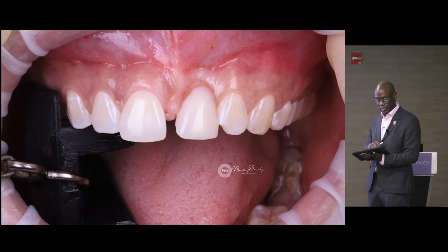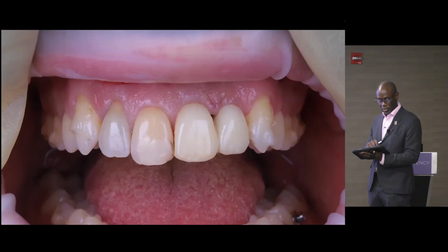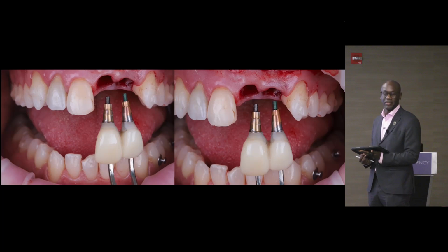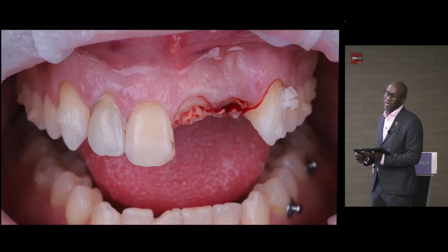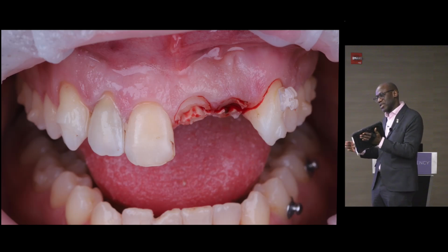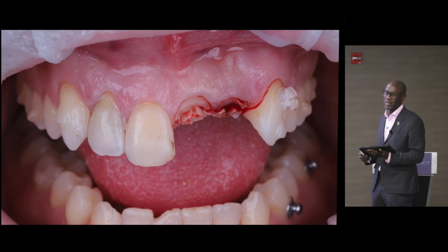I just want to see the shape of those temporaries. You want to see the shape of the temporaries there? Yeah. Slightly concave. Are you still supporting the tissue? Yeah. You said the extraction, the socket shield, are you sectioning the root and leaving that buccal aspect? Yes, that's what I'm doing there. And the danger with that is that if you have your prosthetics too bulky, too soon, you're going to push on that bit of root, which means that it's not going to work. Okay. Thank you for the questions.